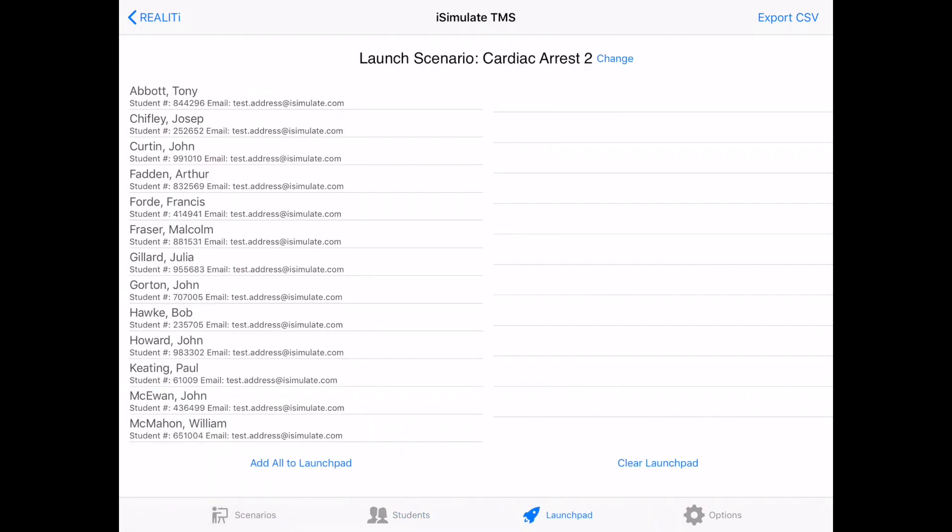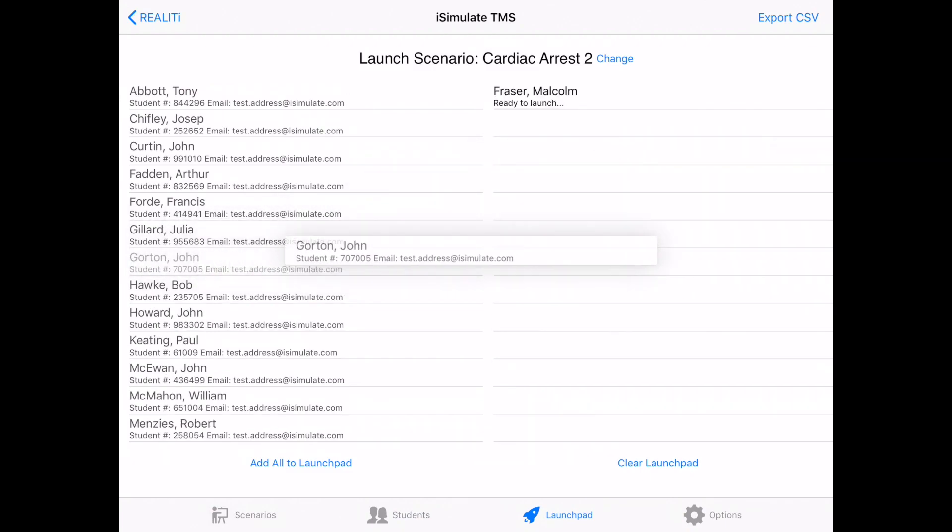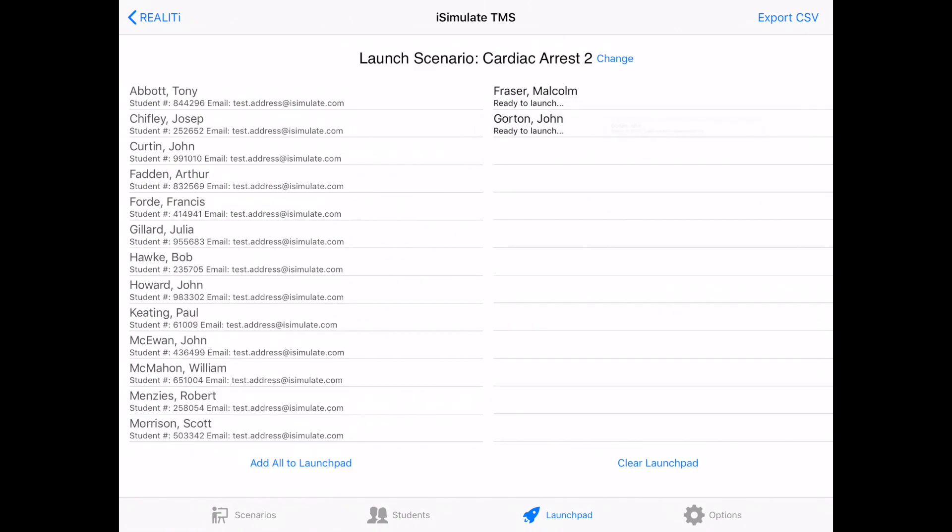The launch pad is a really useful screen. And here you have all the students listed down the left hand side. But what we can do is we can drag and drop each one of these students over to the launch pad on the right hand side. And here we are moving two across.